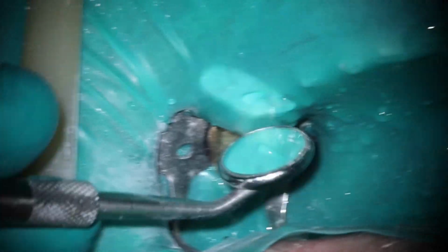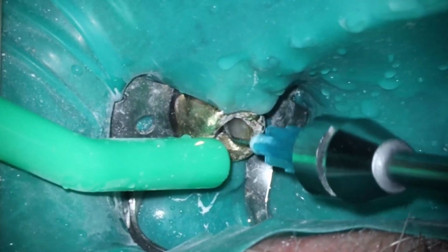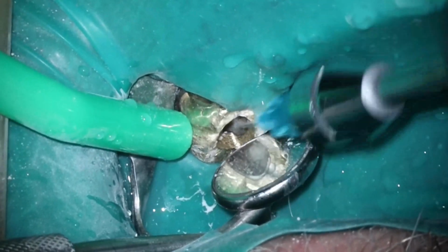As you can see, the access was a little bit too much towards the lingual. So that was me having the patient move his head to try to get a little better access to it. I know it's a little bit difficult to see with it not all the way zoomed in, but they had found the mesial lingual and the distal canal, but they had not gone all the way to the mesial buccal. So what I'm going to do here in just a second is take that workhorse burr and go along and clean out, find the canal, and then we'll have a surprise to all of us, to everybody's surprise here.